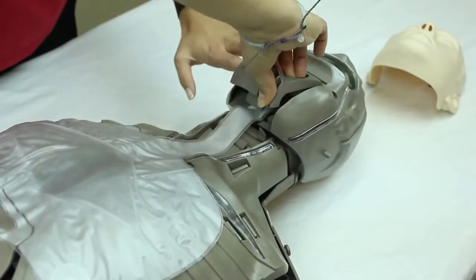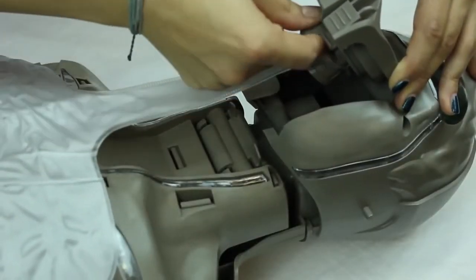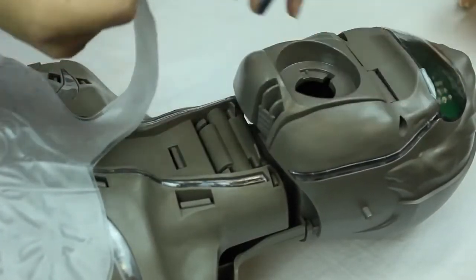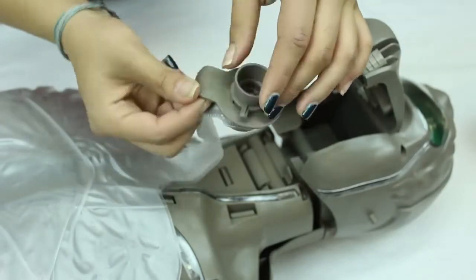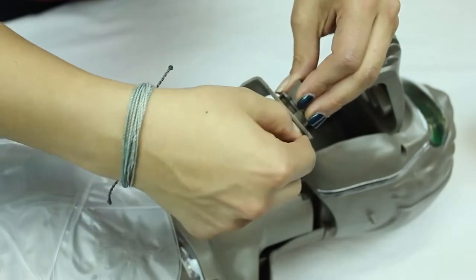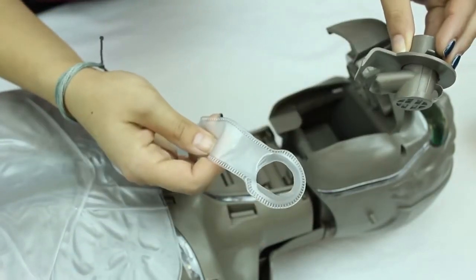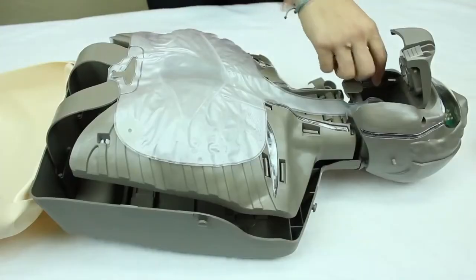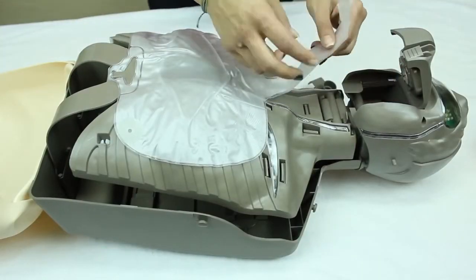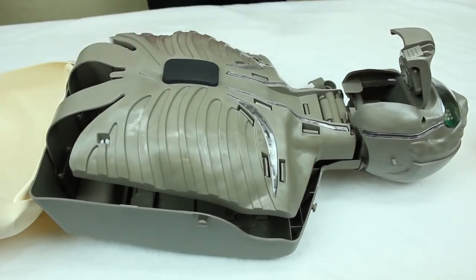Unclip the jaw area, then grab the handle and turn it to the left. Grab the top of the lung bag and pull it off. Once you get the lung bag out, pull it off the mouthpiece and throw it away.